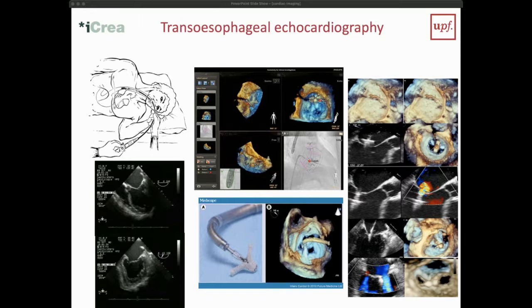Because of this, of course, we like to limit transoesophageal ultrasound to the times that we really need to get the details. These are very often when we want to look at the atria, we want to look at the valve, or we do interventions of the valves. Sometimes your valve is leaking because your heart became so big that your valve is being stretched, so that the leaflets are not touching each other anymore. While wanting to close, they cannot fully close. And so you get problems with, as we said, volume overload and regurgitation.